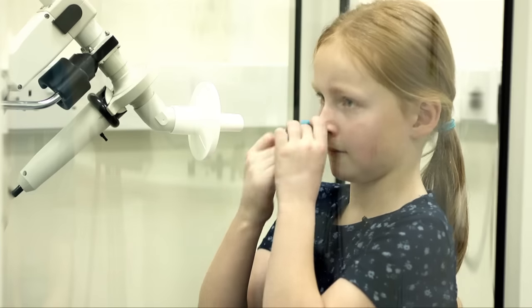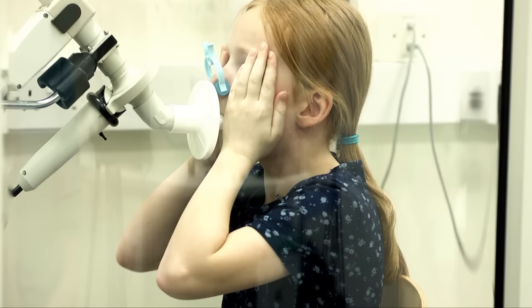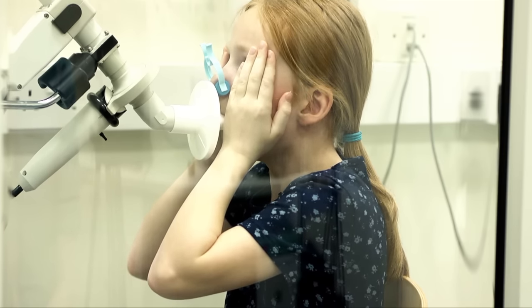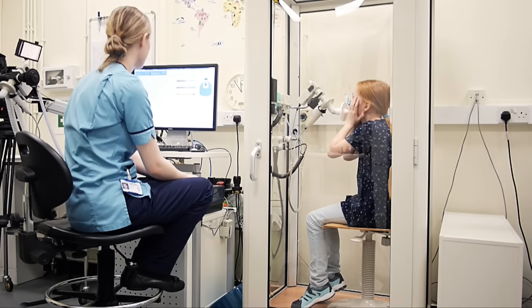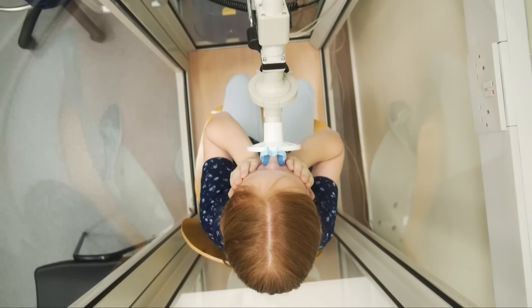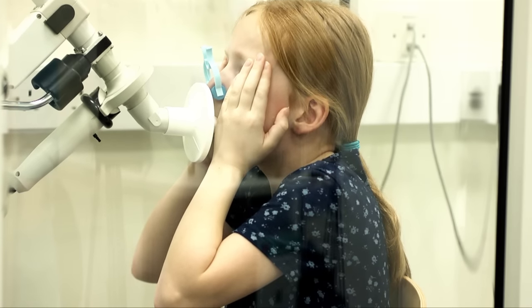So if you want to put your nose pegs on your nose and put your lips and teeth around that mouthpiece for me and sit up nice and tall and hands up onto your cheeks. That's it. And we're just going to breathe nice and normally in and out to start off with. So just in and out. Well done. So I'm going to close the shutter now, so you breathe in, out, and then blow all the way out to empty your lungs, squeeze, squeeze, squeeze, all the way out, and a really big breath all the way in, and all the way out, long as you can, squeeze, squeeze, squeeze, and off you come and have a rest.